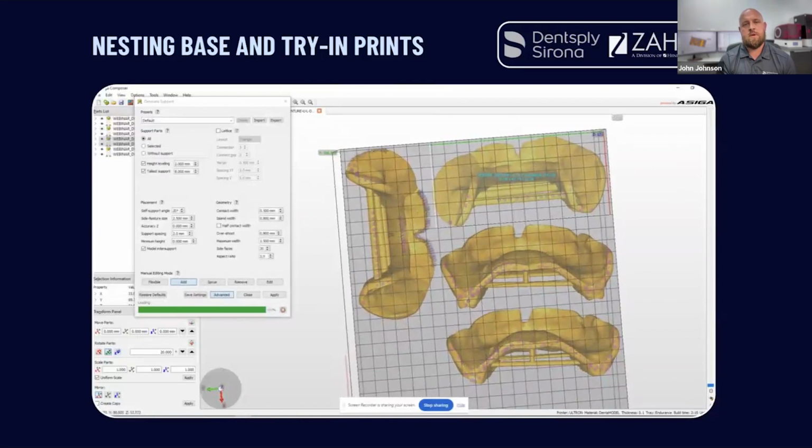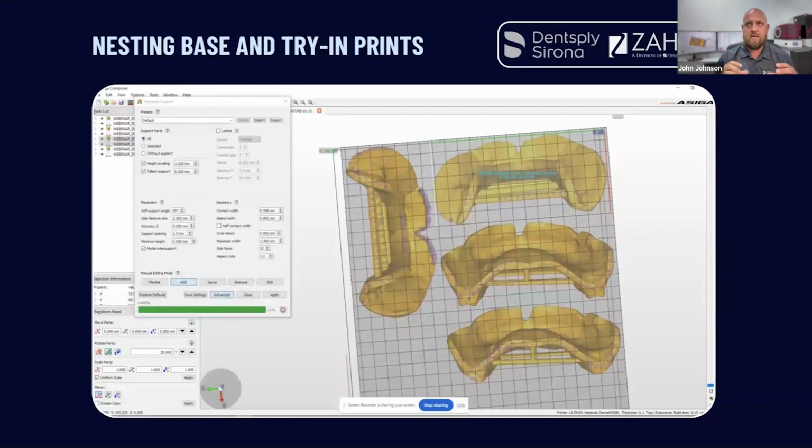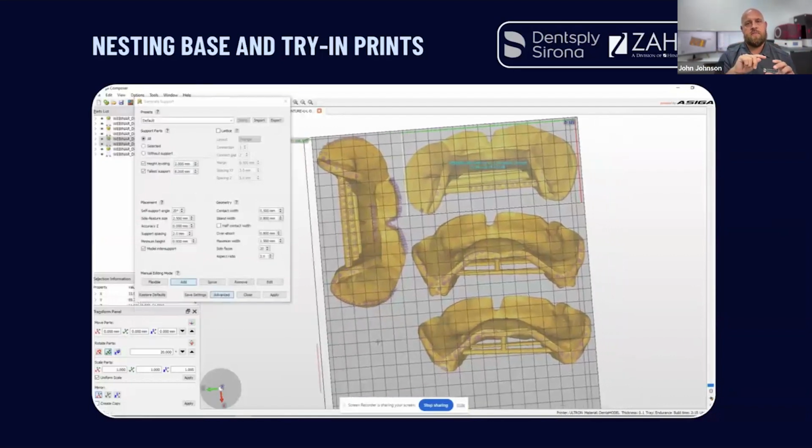And what you have to really think about is the printer has a build platform that's going to go down into the resin and work its way up. So essentially you could take a ream of copy paper and consider that as your slices, right? Any part of that print that arches over where it doesn't have anything below it is unsupported.